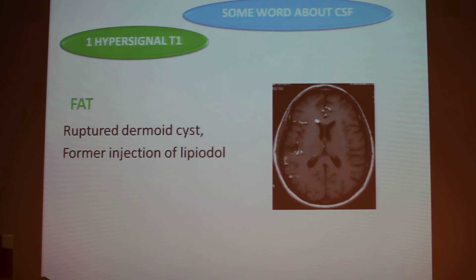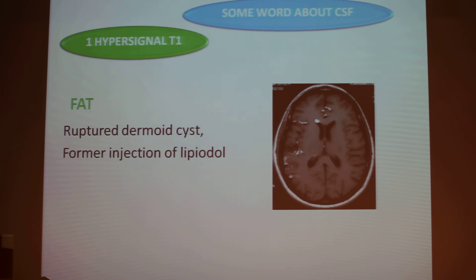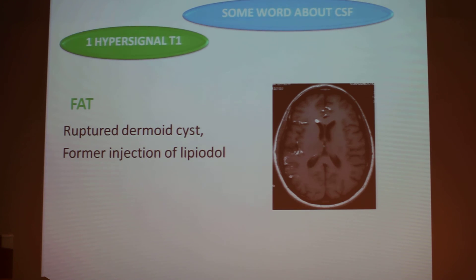After blood, sometimes you can see fat — this was the case of a rupture of a dermoid cyst into the subarachnoid space, and you can see there is fat in the ventricles and in the sulci. It's really very striking.